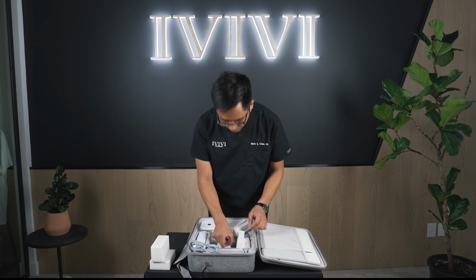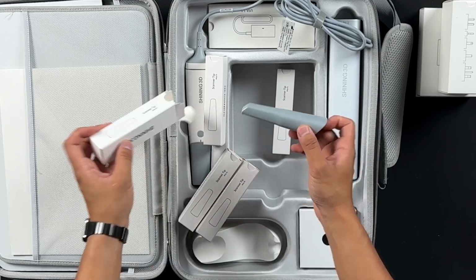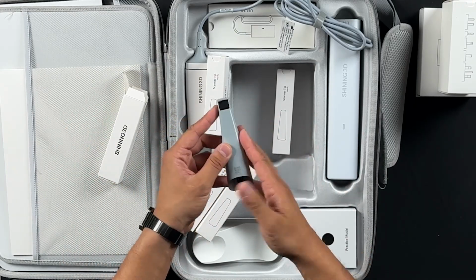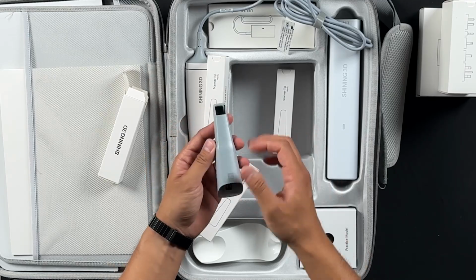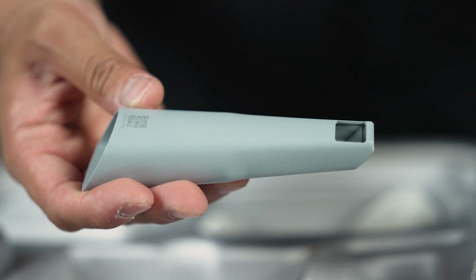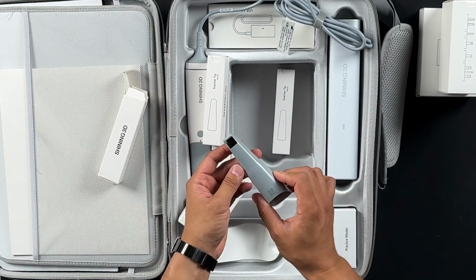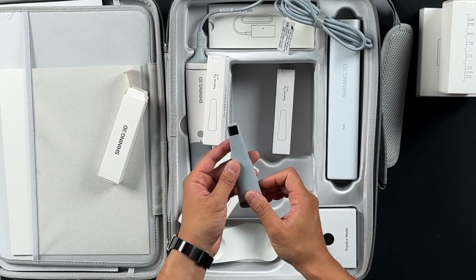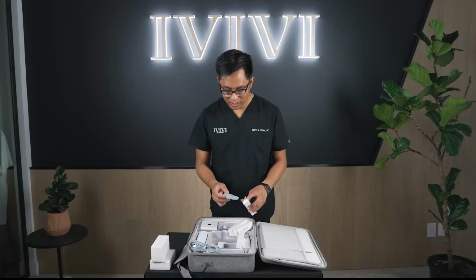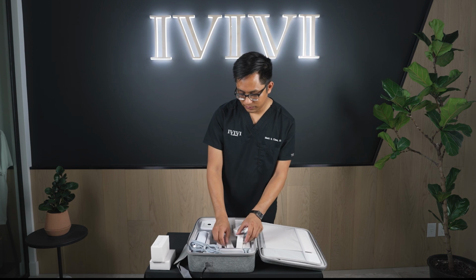Let me find it here. Oh, there's a small one, it says S. So for those who are doing pediatric dentistry, this is also a really nice option for the smaller mouths that we may see, or even for those patients that can't open their mouths quite wide. Some of our denture patients have microstomia, I believe. So this is also pretty useful for those situations. Smaller field of view, but definitely useful depending on the clinical situation. All right, so put that to the side.